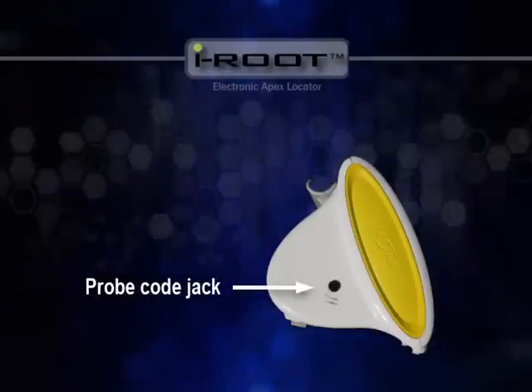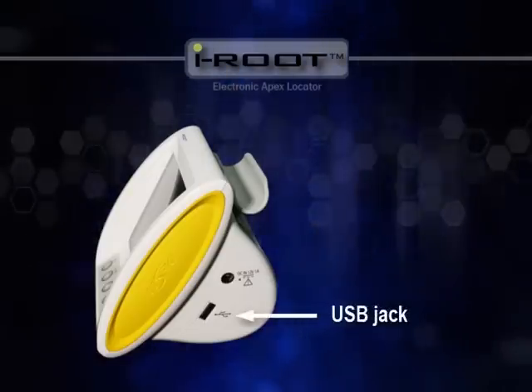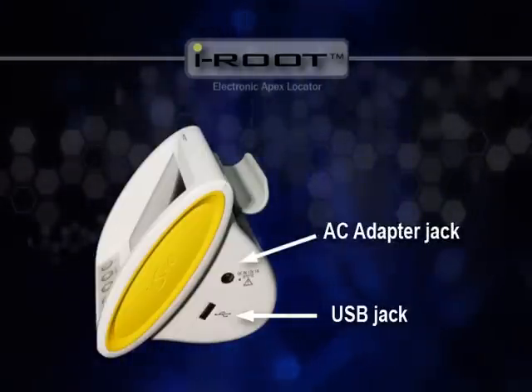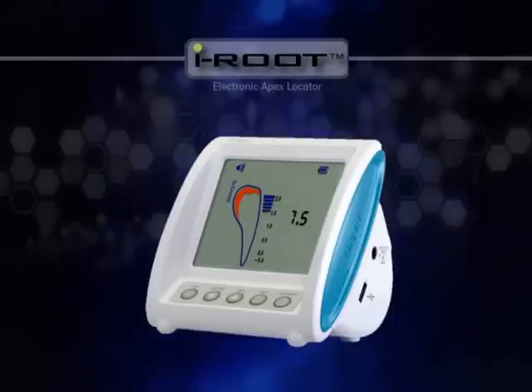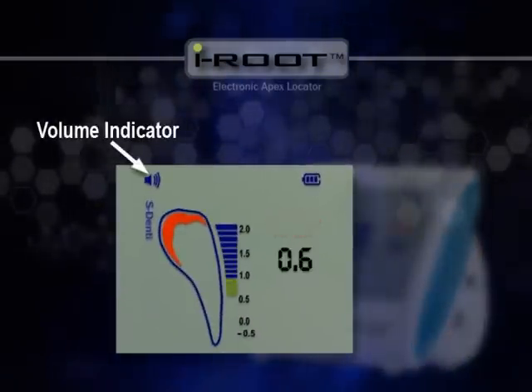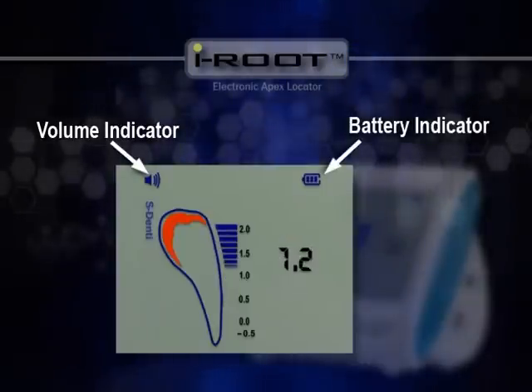On both sides are the probe cord jack, USB port for software options, and power adapter jack for charging. The battery cover is located on the back of iRoot. Details on the LCD screen include a volume indicator on the top left corner and a battery indicator on the top right corner.